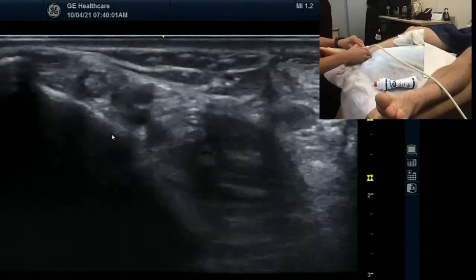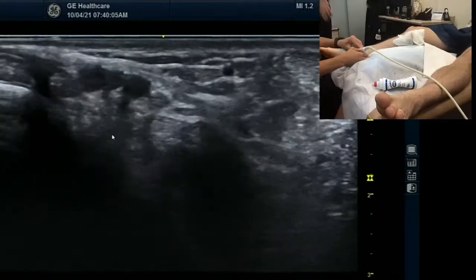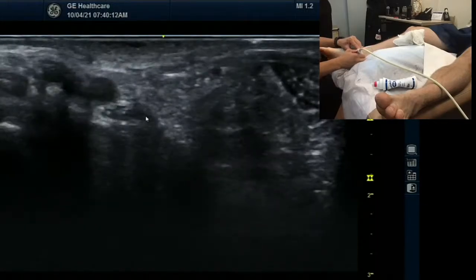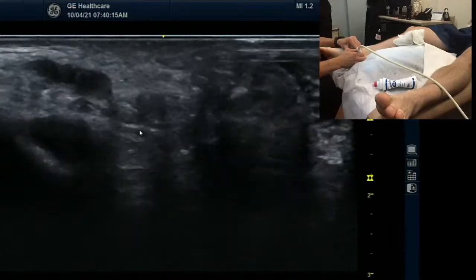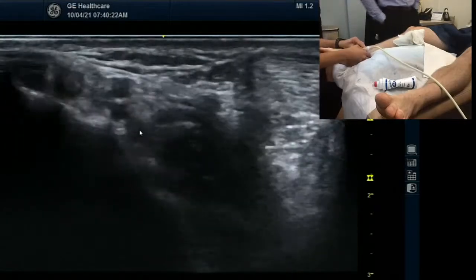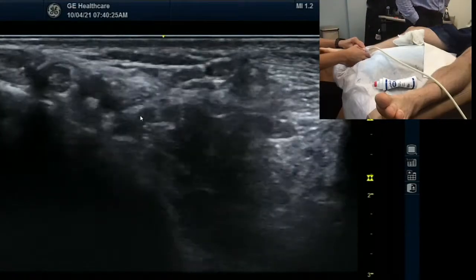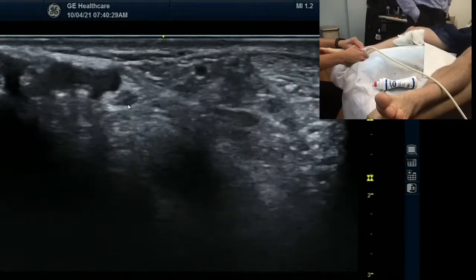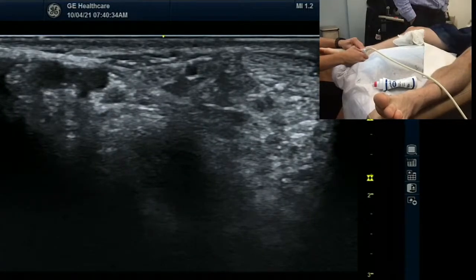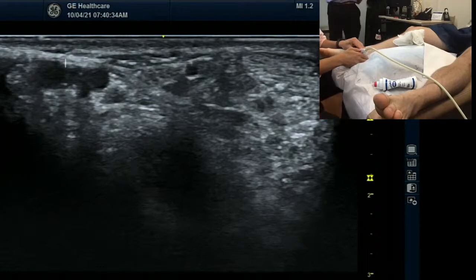So we have the tibial nerve. You see that division there? I can be convinced there's a division there. You point — then I can assist. So here — it's the tibial nerve. And then basically come down. And then look — this is the tibial nerve still. There's a division coming off of that. This one. Stay there. Patrick, stay still, stop moving that foot. So we're going to comment — this is probably number one. And this is number two. We've got to find and figure out what it is on Patrick.